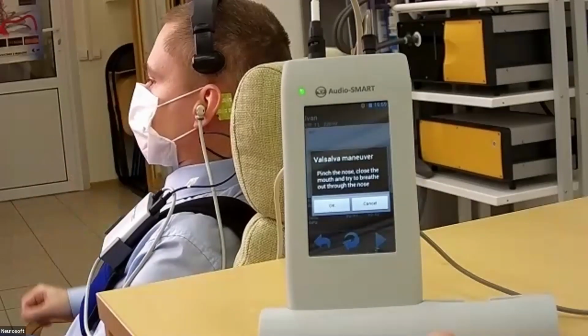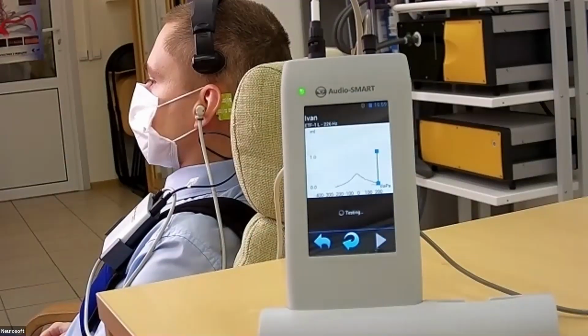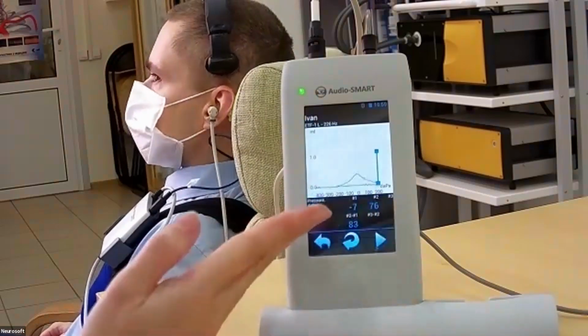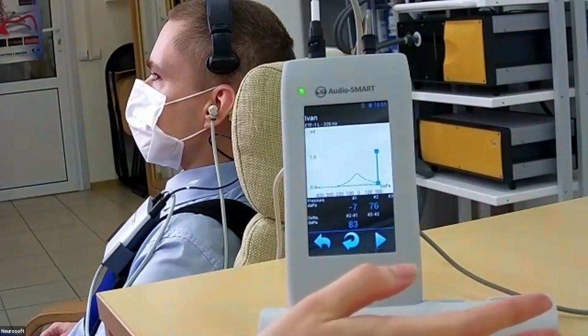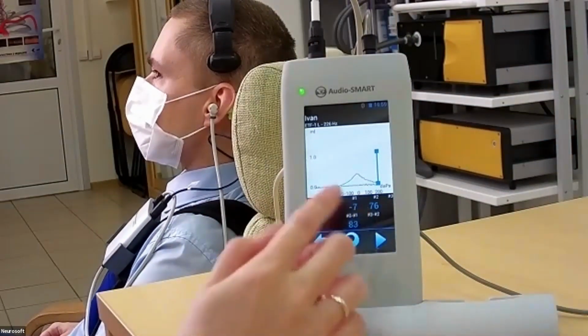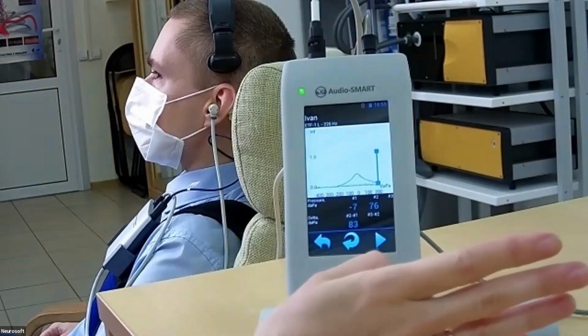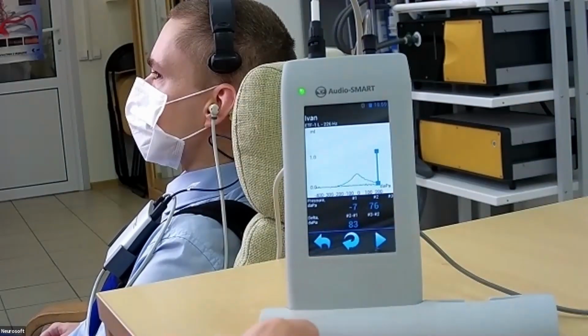Okay, let's try. And we see that the peak actually goes out of our window, I think. So in these cases, the peak goes to the positive values which are not on our screen. In such cases, what can we do?